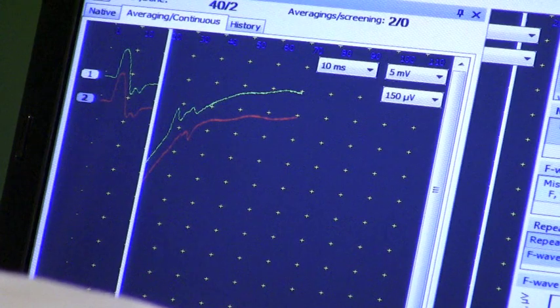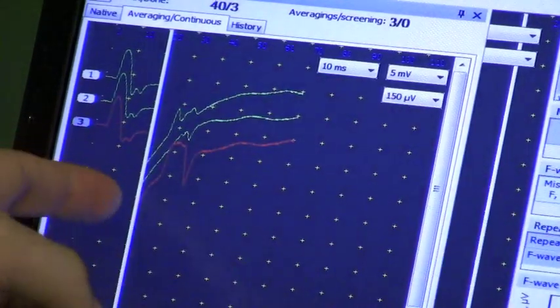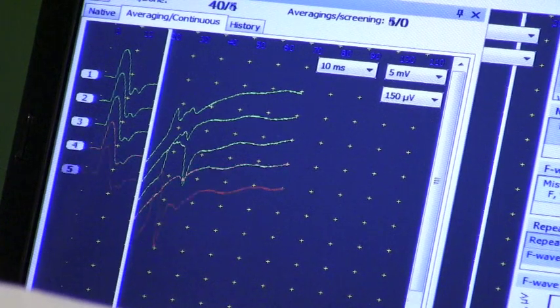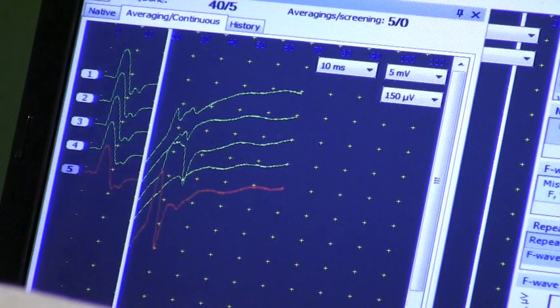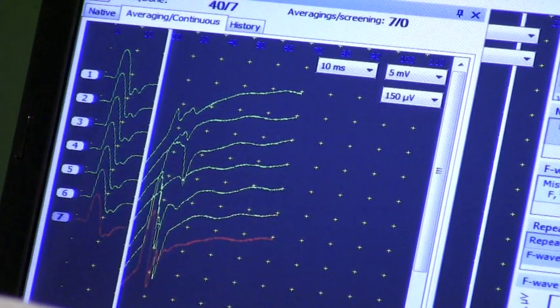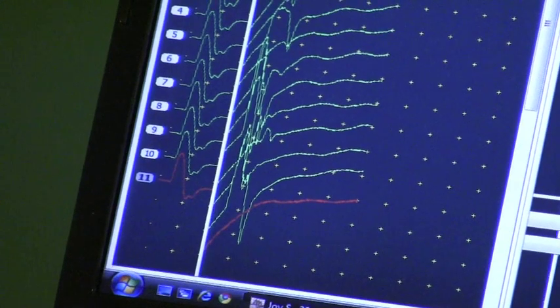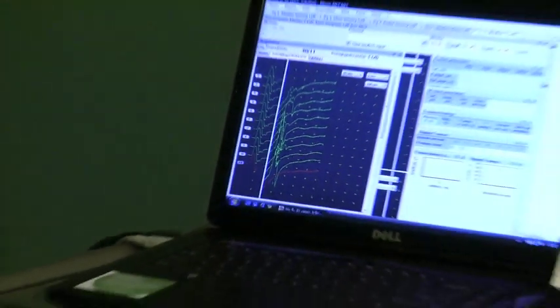One shock, two, nice F wave here. You see that, because she was squeezing. Three, four, very nice one. Five, six, seven, eight, nine, ten. Thank you very much. That was great, and that squeezing really did it.